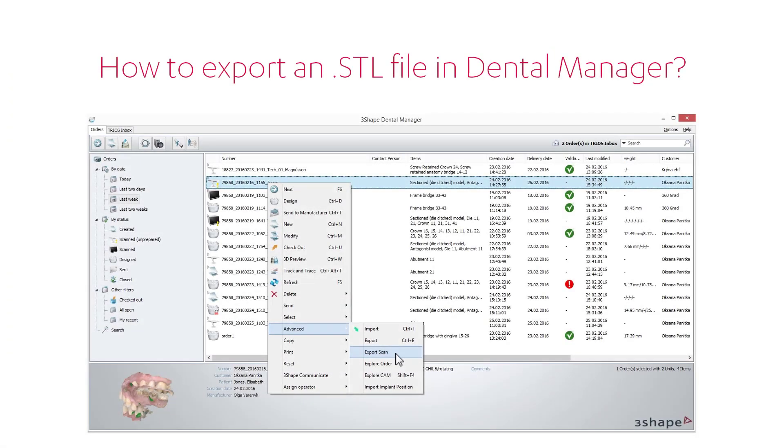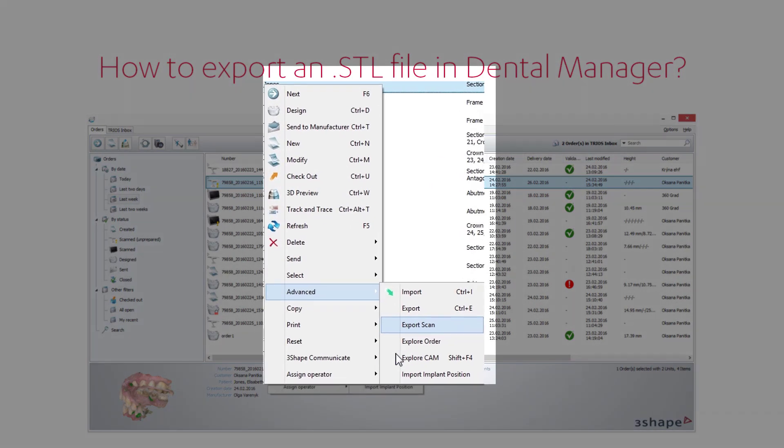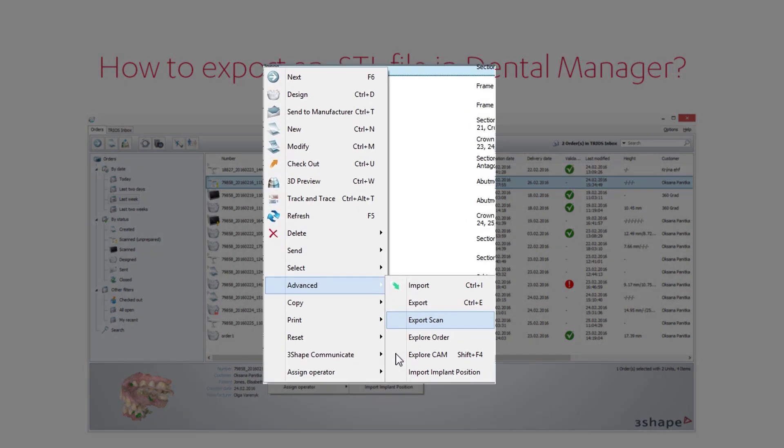When you want to export an STL file, you need to enter the Orders tab. There, in the Advanced submenu, you'll find this option.